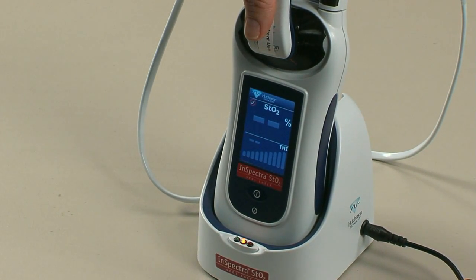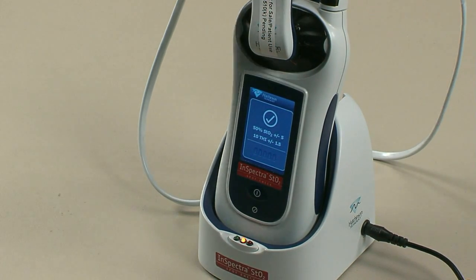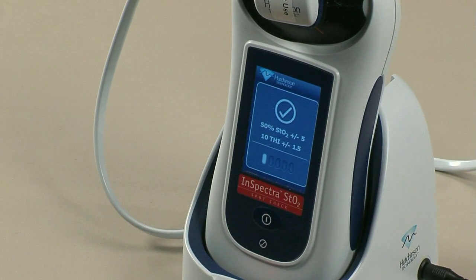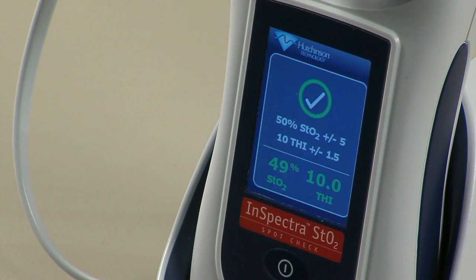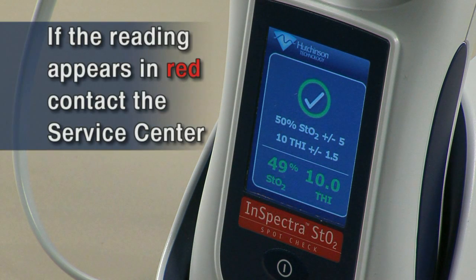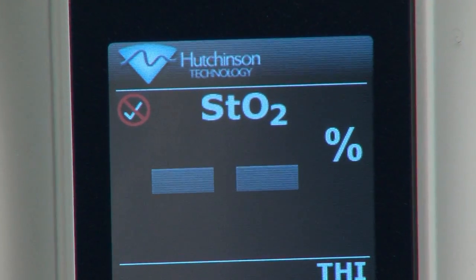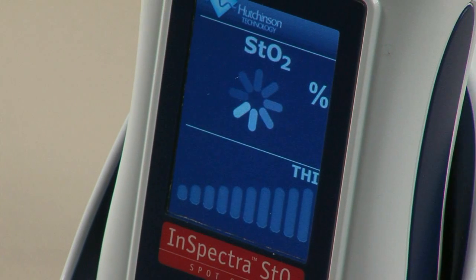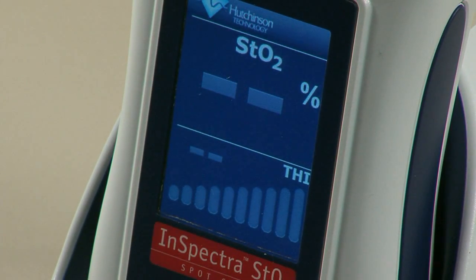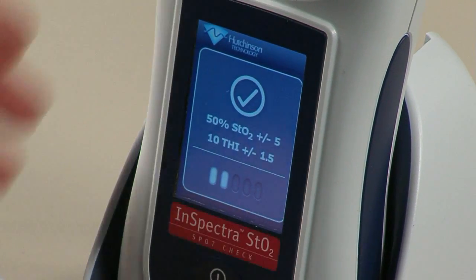To take a system check reading, place the InSpectra STO2 clip on the top of the device and press the System Check button. After approximately 20 seconds, the STO2 measurement and THI will be displayed. The reading will appear in green if within range, or red if out of range — contact the service center. If the system check reading failed, the fail icon will remain on the screen until the reading passes; do not measure a patient's STO2. Refer to the troubleshooting guide. All system check readings automatically clear after 5 seconds. To cancel a system check reading at any time, press the System Check button to return to the main screen.